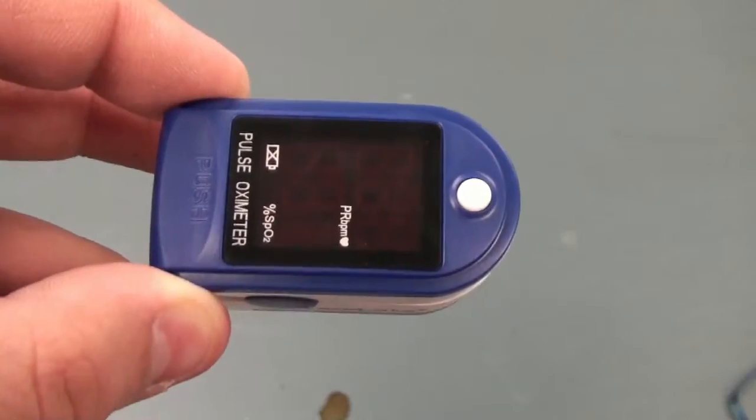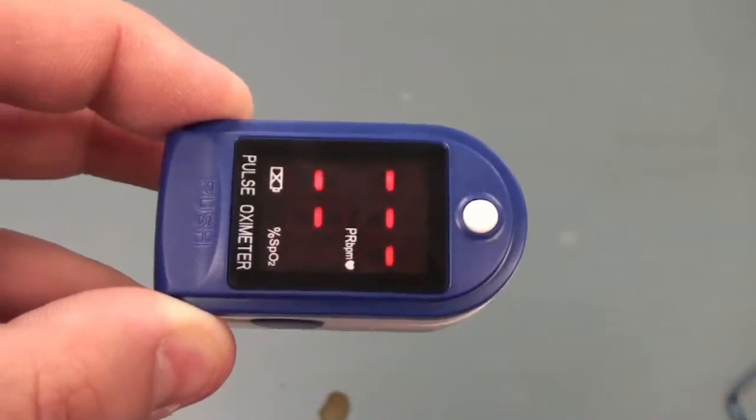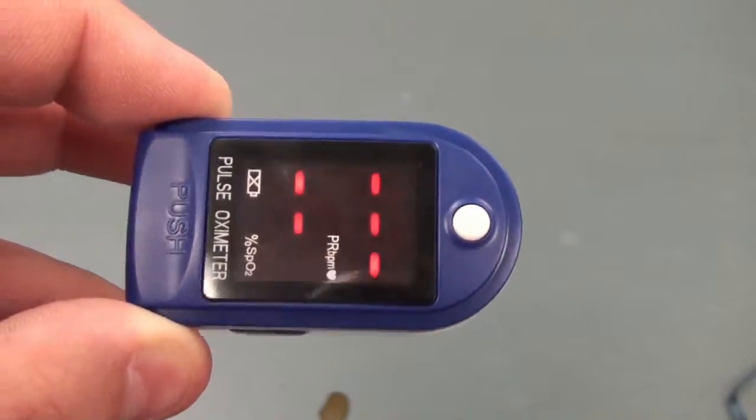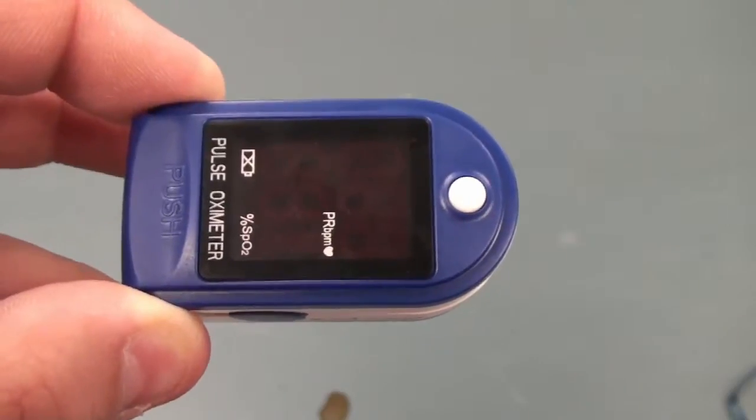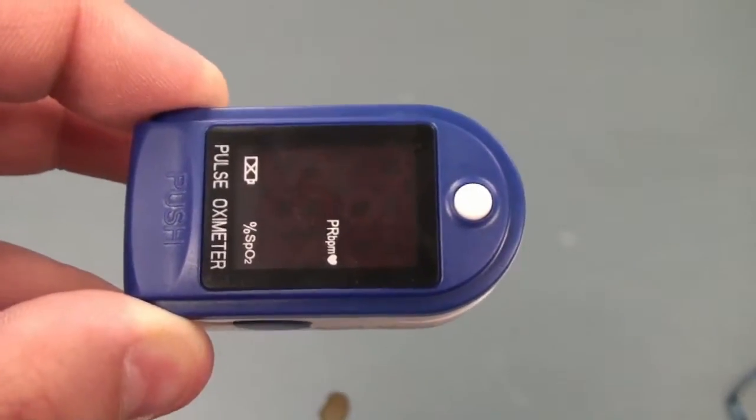To turn the device on, press the white button. You'll notice the screen LEDs light up and will go off if the finger is not placed inside.